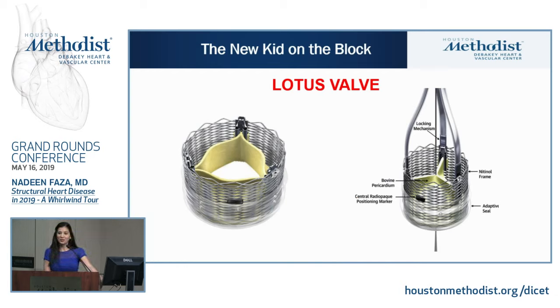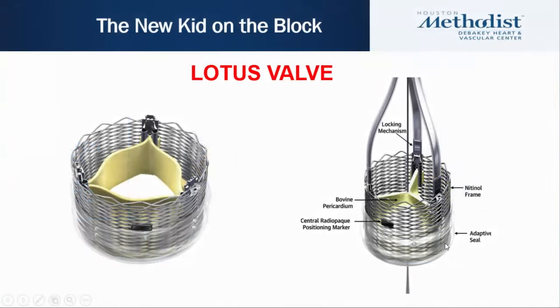This brings us to the new kid on the block, the Lotus valve. This is a mechanically expandable valve. It has central radio-opaque positioning markers, an adaptive seal here to, again, reduce PVL, and has a locking mechanism with a bovine pericardium from the inside.